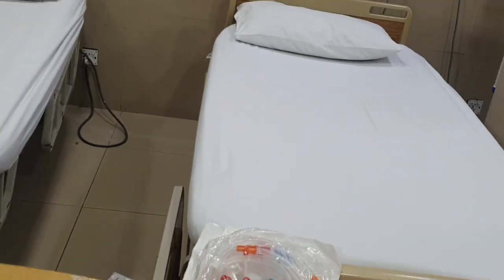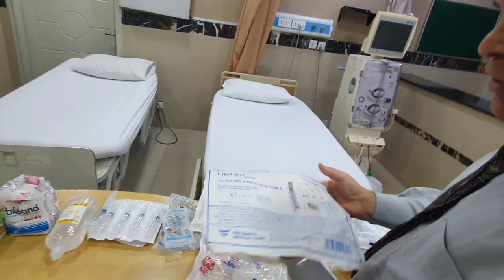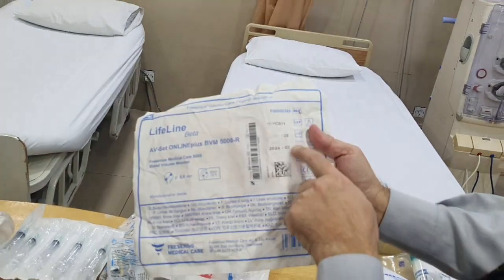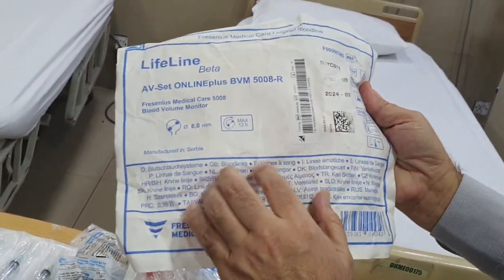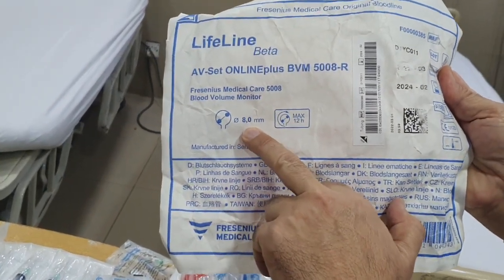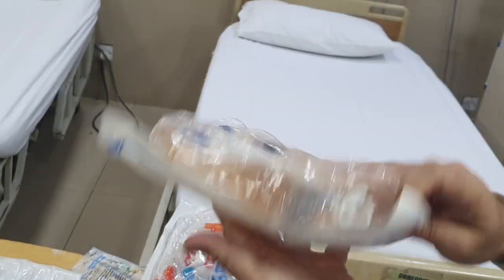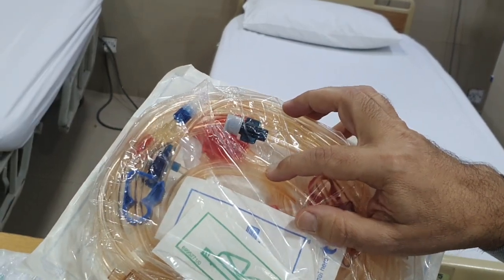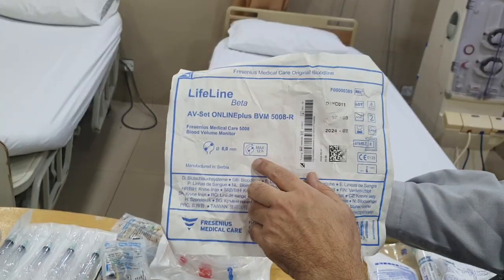This one is a specific blood tubing line. This is the blood tubing line for the Fresenius 5008 machine, and it says here 5008R. Once again, you've got the manufacturing date, you've got the expiry date at the back, and plus you've got the diameter. So this is an 8 millimeter blood tubing line. And 8 millimeter lines are larger in caliber. Because they're larger in caliber, you will get more clearance from these blood tubing lines, because the blood has to flow through it.